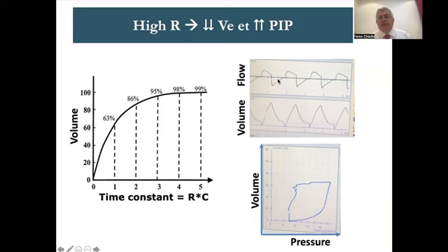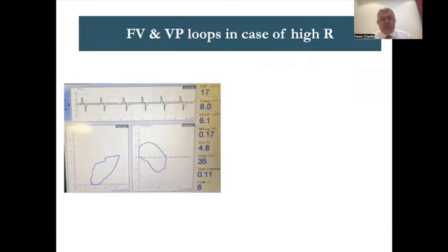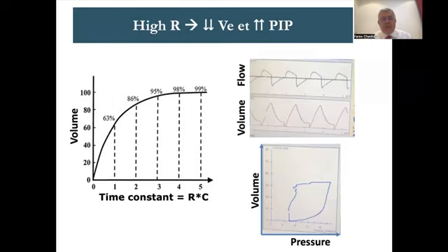The expiratory flow returned to 0, so expiratory time was just enough here. So at every breath, we are cutting short the I time and losing a bit of volume. So if the I time is short, my question to you, what would you do? The classic answer: I time is short, I will increase I time. That is wrong. Often I will answer this way: I time is short, is it increased resistance until proven otherwise? I'll explain to you why.